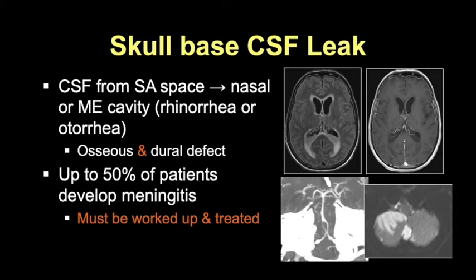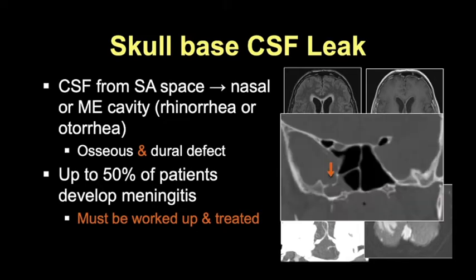It's imperative to diagnose and treat a CSF leak, as untreated CSF leak can lead to meningitis in up to 50% of cases, as in this case of a patient with a recent history of facial trauma who presented with altered mental status and awful meningitis with FLAIR signal abnormality in the sulci, ventriculitis with debris layering dependently in the ventricles, and posterior circulation vasculitis leading to infarctions. All due to this undetected right sphenoid wing fracture that occurred at the time of his facial trauma 1 week previously.